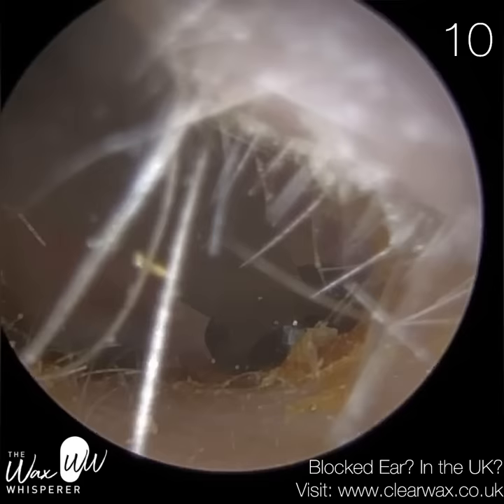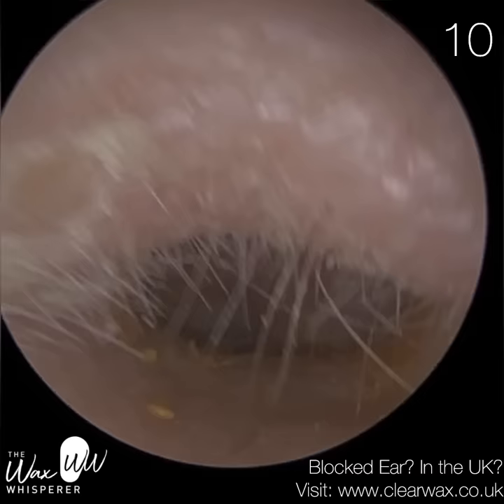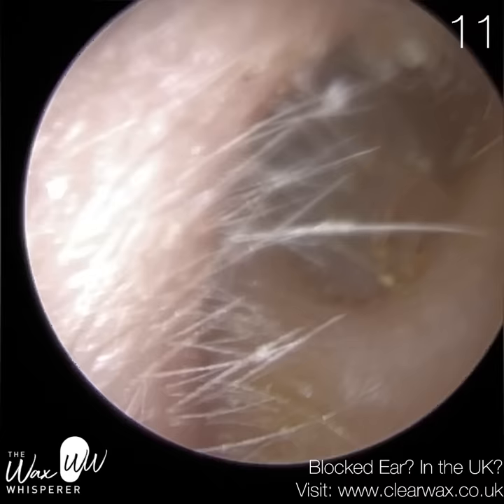We can also have an anterior recess — a little crevice at the front wall of the ear canal near the eardrum. Quite often, if you weren't using an endoscope, it's hard to visualise the anterior recess and sometimes the inferior recess. An endoscope allows visualisation of both.